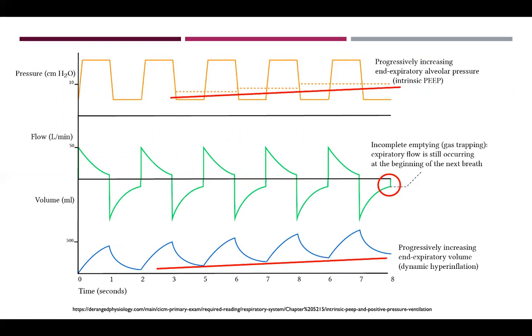In some of the ventilators, it actually is reported breath by breath as a separate measurement as well. On the output side of the ventilator, whatever the ventilator is measuring, there's one component called PEEP I, or intrinsic PEEP, with the small i. You can look at that and see if it matches your set PEEP or is within 1 or 2 centimeters of water, then you know that you don't have a significant intrinsic PEEP. On the other hand, if you set the PEEP at 10 and the machine says the intrinsic PEEP is 14, then you have a component of intrinsic PEEP.